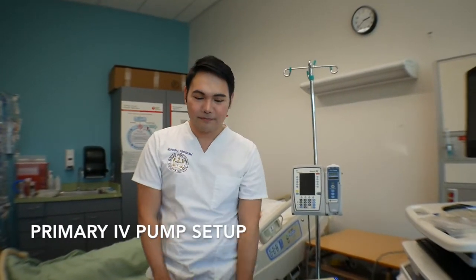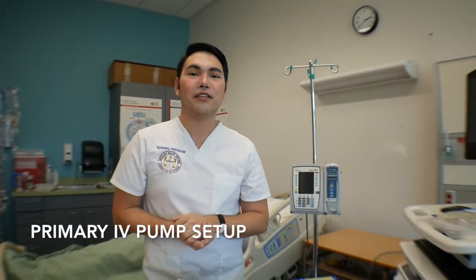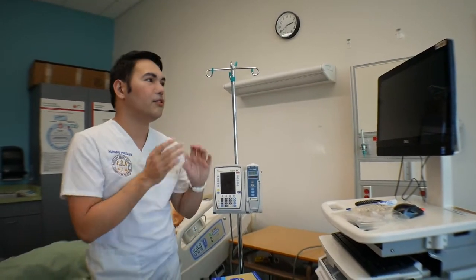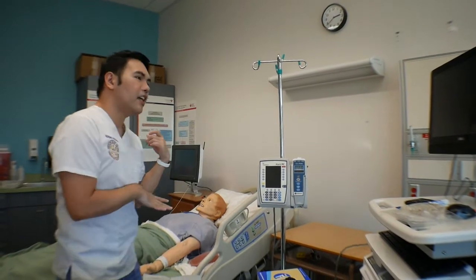Alright, now I'm going to show you how to prepare an infusion system. First, you're going to verify the order of your doctor. You're going to check your computer and see if the bag is actually ordered by your physician for the patient. I've checked that. Now I'm going to go to my patient and take a look at him.